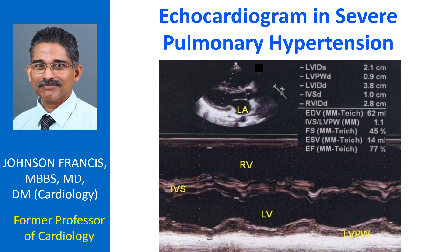Echocardiogram in severe pulmonary hypertension. M-mode echocardiogram shows a dilated right ventricle; mainly the outflow region is seen in this view.